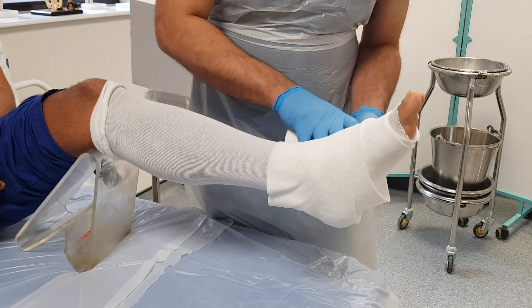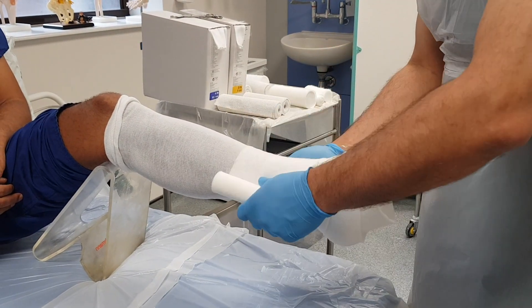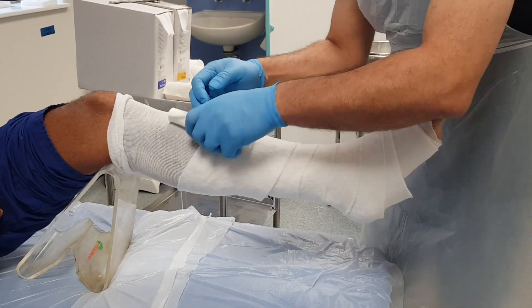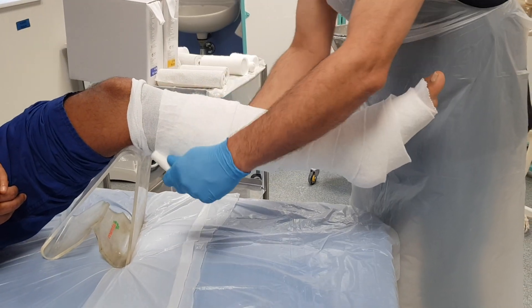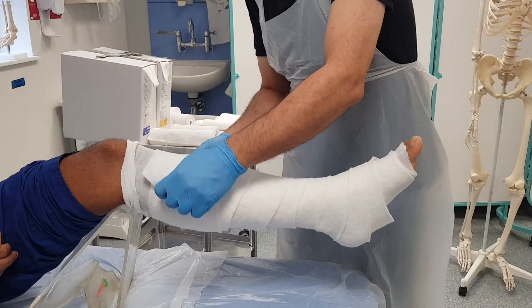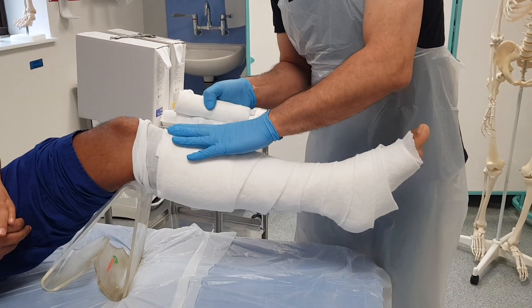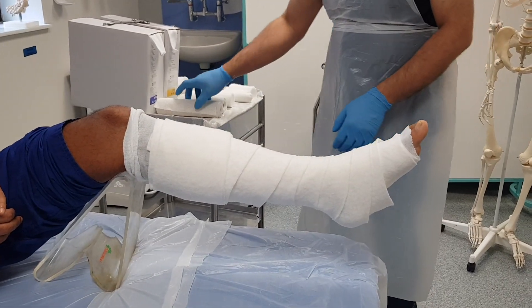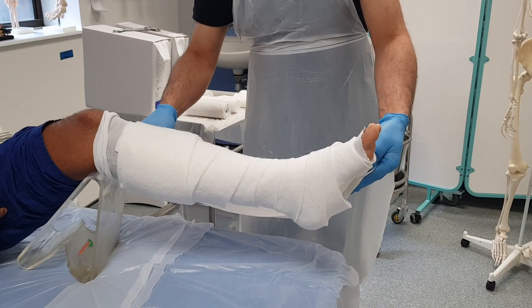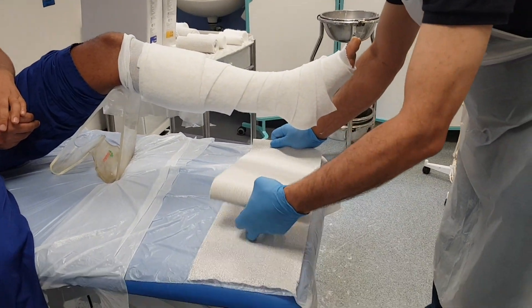I might want to cover the bony prominences with some plaster felt or with a piece of gauze, overlapping 50% every time. I haven't quite got two complete layers there so I'm going to apply a little bit more at the proximal end, then cut that off. Now I want to measure out the length of my back slab.